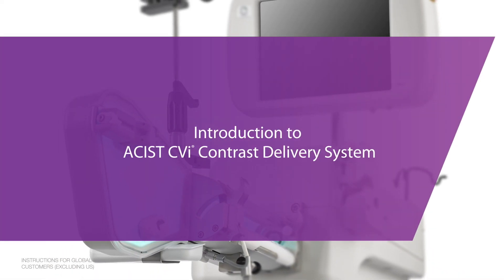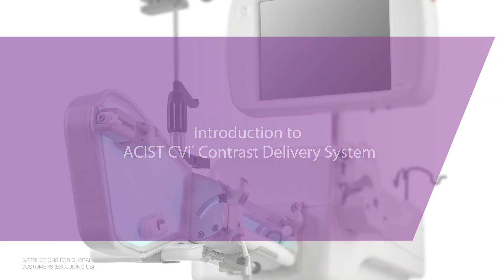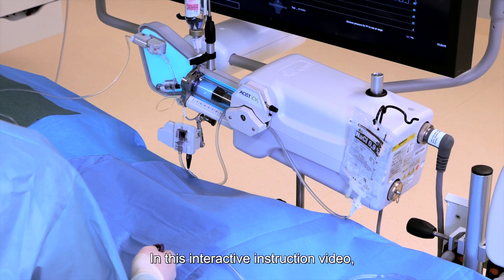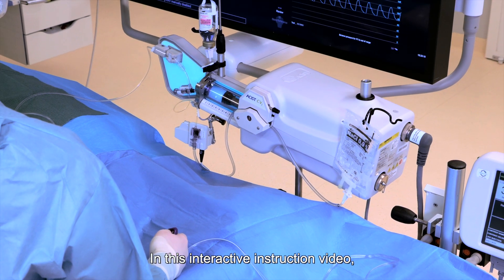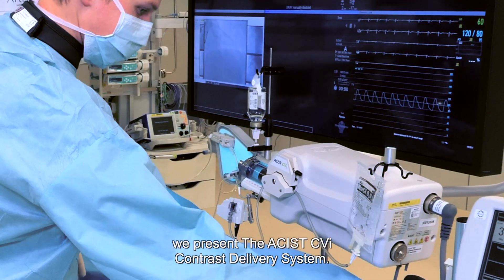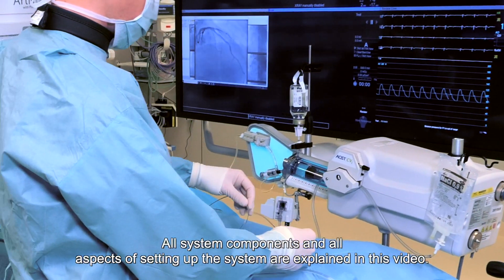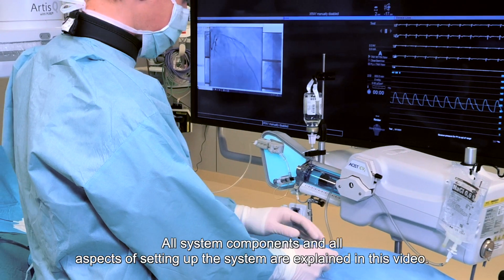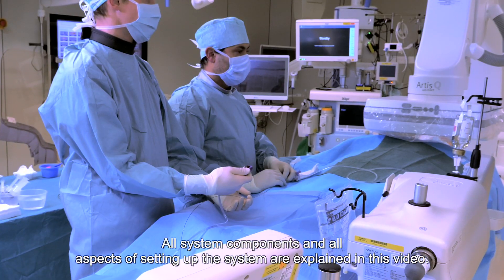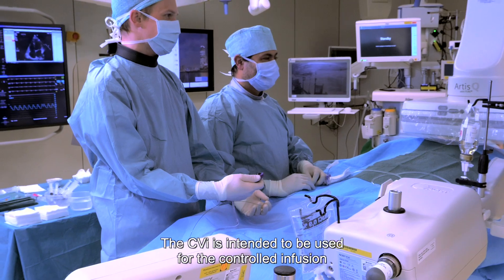Introduction to the CVI contrast delivery system. In this interactive instruction video, we present the Assist CVI contrast delivery system. All system components and all aspects of setting up the system are explained in this video.